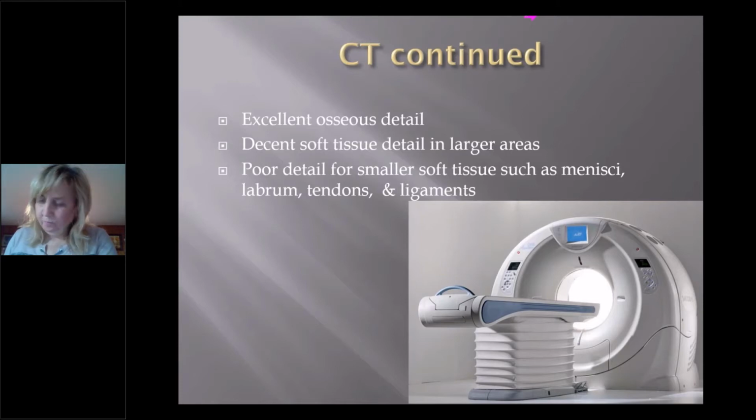As that patient is laying there, this thing right inside here spins around and around at a very high rate of speed. As it's spinning around, one side where my cursor is shoots an X-ray beam. The other side where my cursor is catches it. It's constantly spinning around the patient, constantly shooting all the way around and catching on the opposite side.